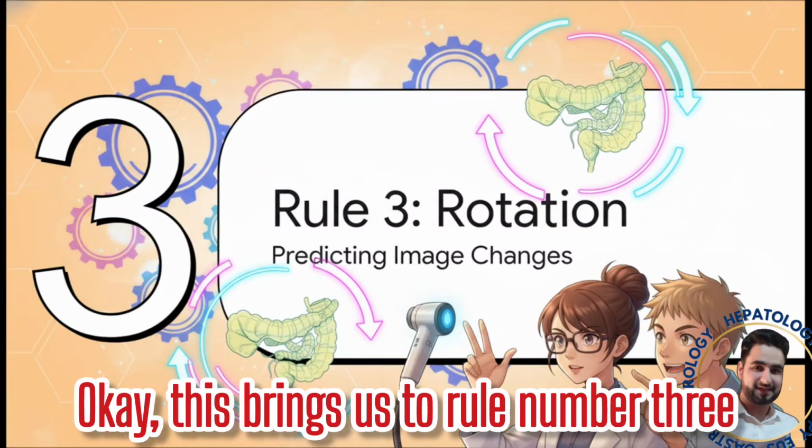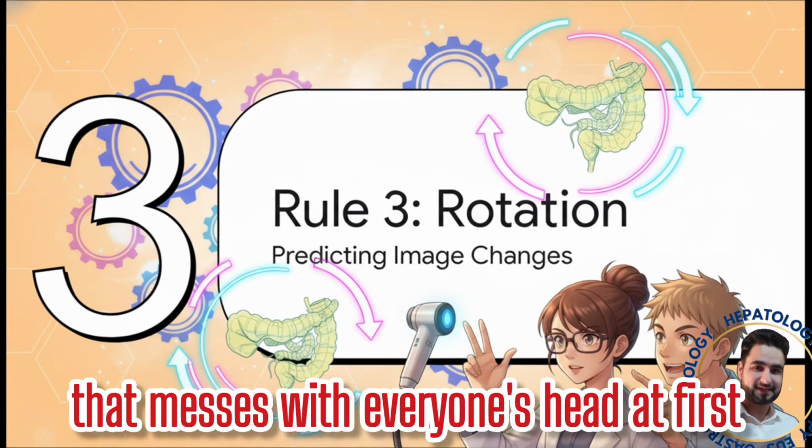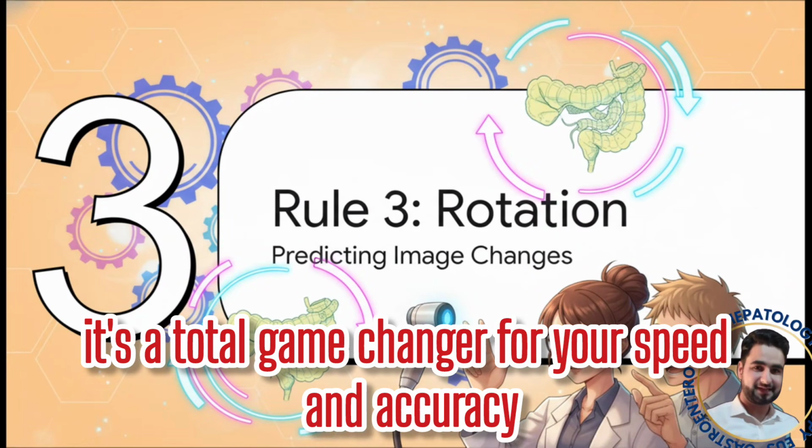Okay, this brings us to rule number 3. And I'm going to be honest, this is the one that messes with everyone's head at first. It's the most counterintuitive rule of the bunch, but I promise you, once this one clicks, it's a total game changer for your speed and accuracy.